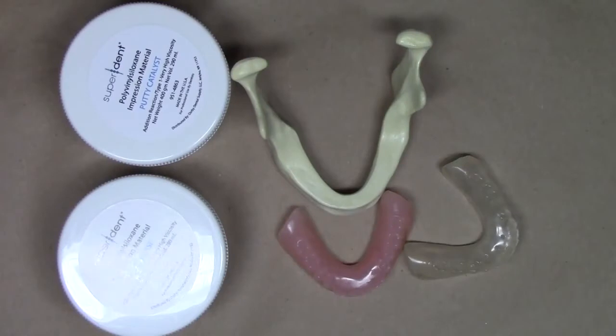Hello, this is Dr. Michael Shear with Learn LODI, a free resource on how to market, treatment plan, place, and maintain LOCATOR Overdenture implants. The purpose of this YouTube video is to describe a clinical technique to duplicate a patient's existing complete denture into a surgical guide using a simple laboratory protocol.